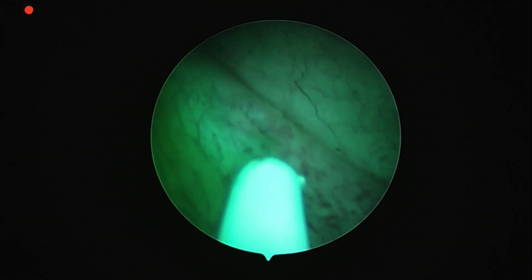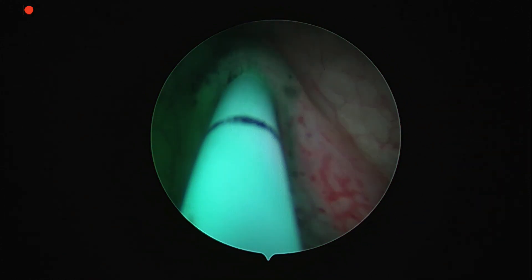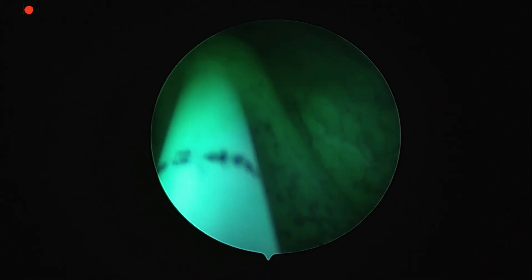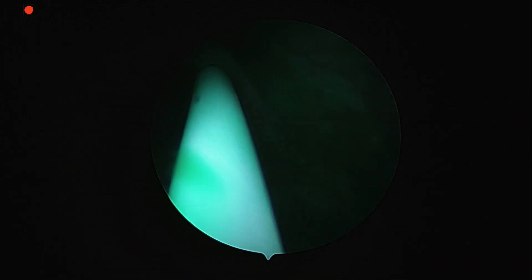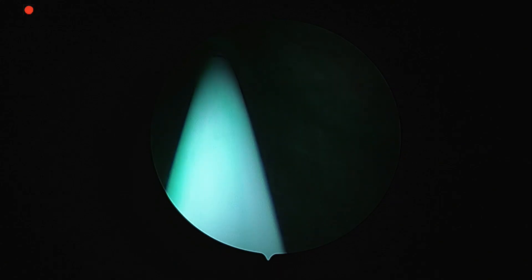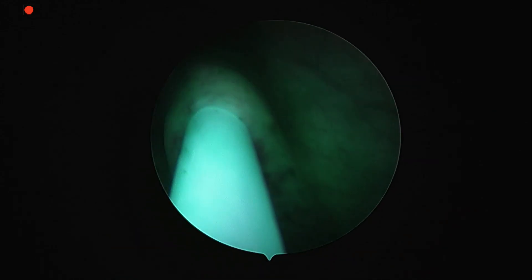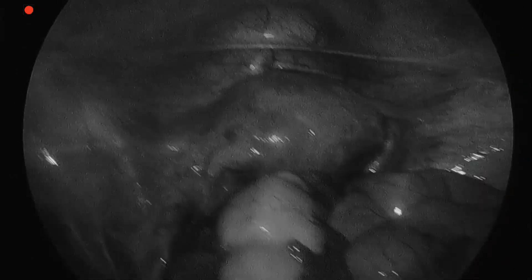In a similar fashion, the right ureter is also cannulated and the ureteric catheter is pushed into it up to 20 centimeters. The alternative to this which was previously used were illuminated ureteric stents which get illuminated throughout the surgery. However, the problem with illuminated ureteric stents is that they keep the ureter taut and prevent it from mobilizing.